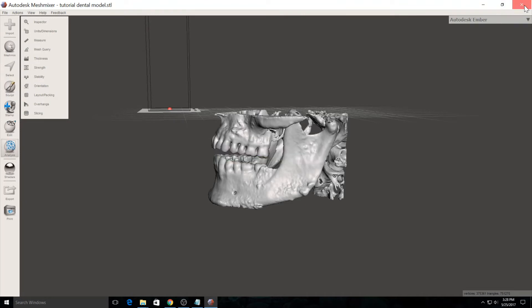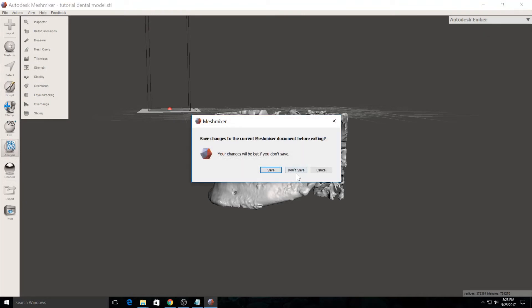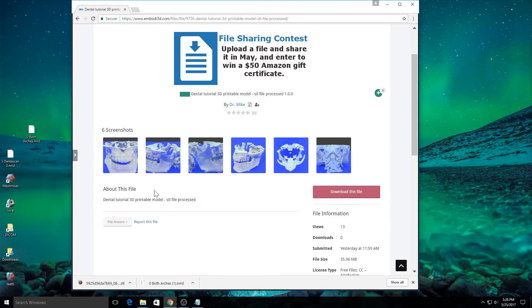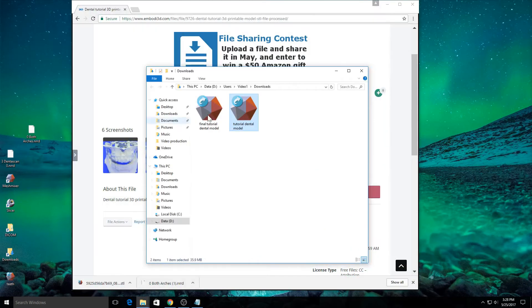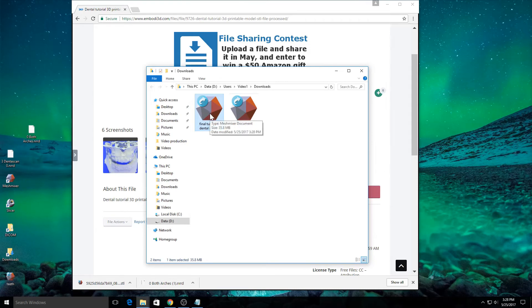We can go ahead and export it in STL format and call it final tutorial dental model and save it. Now our file is now ready to go. We can send this to any 3D printer and go ahead and print it.